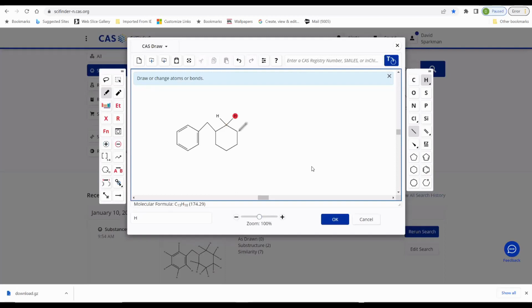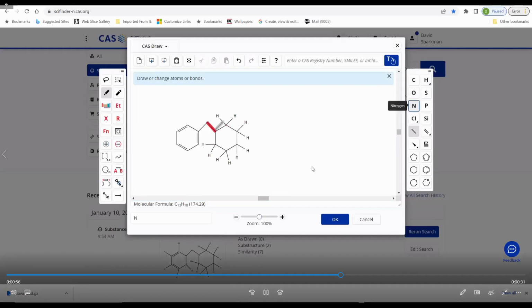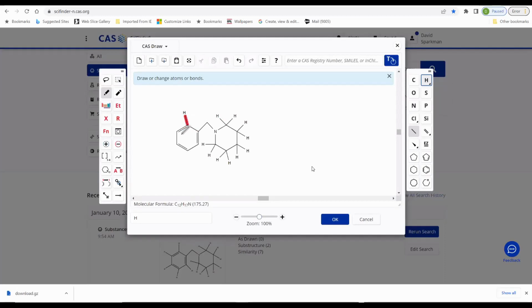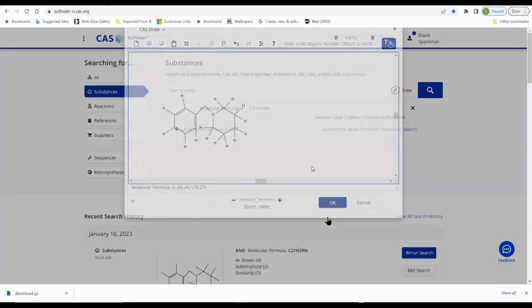And I'm putting hydrogens at every place that I don't want any connections to occur, because the hybrid search within the NIST software showed that this part of the ring was there and there was nothing branched off that part. The only branching occurred was on the central CH2. I put a nitrogen in the ring there, finish off the other hydrogens on the aromatic ring just to show that there's no attachment at that point. So the only place now that we can attach is at the CH2.